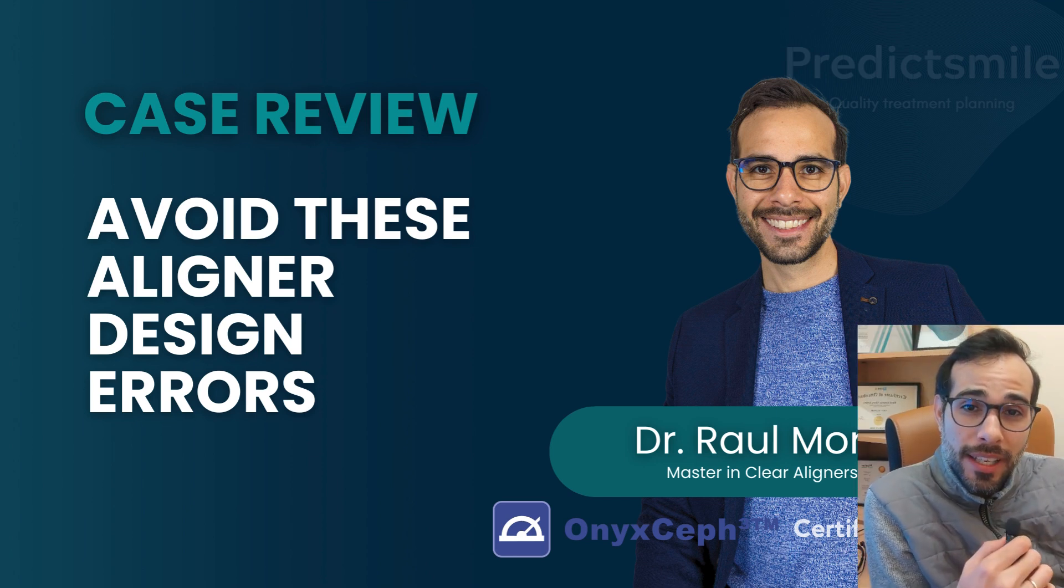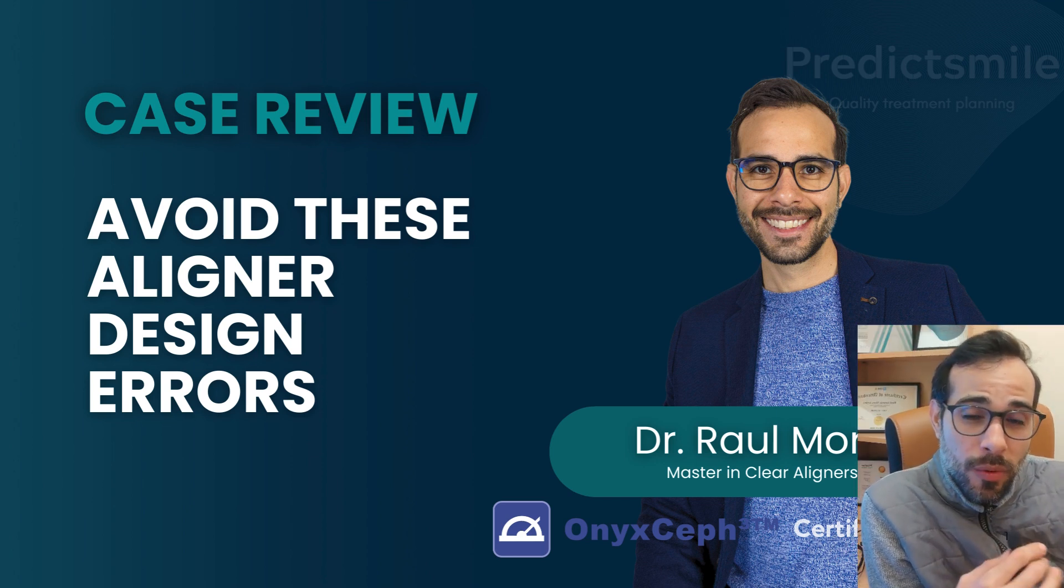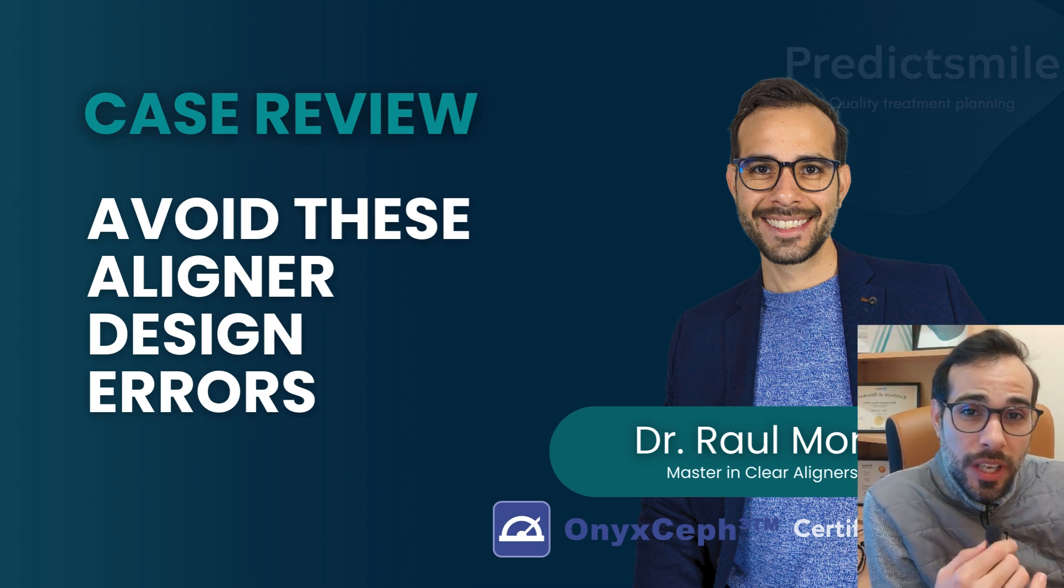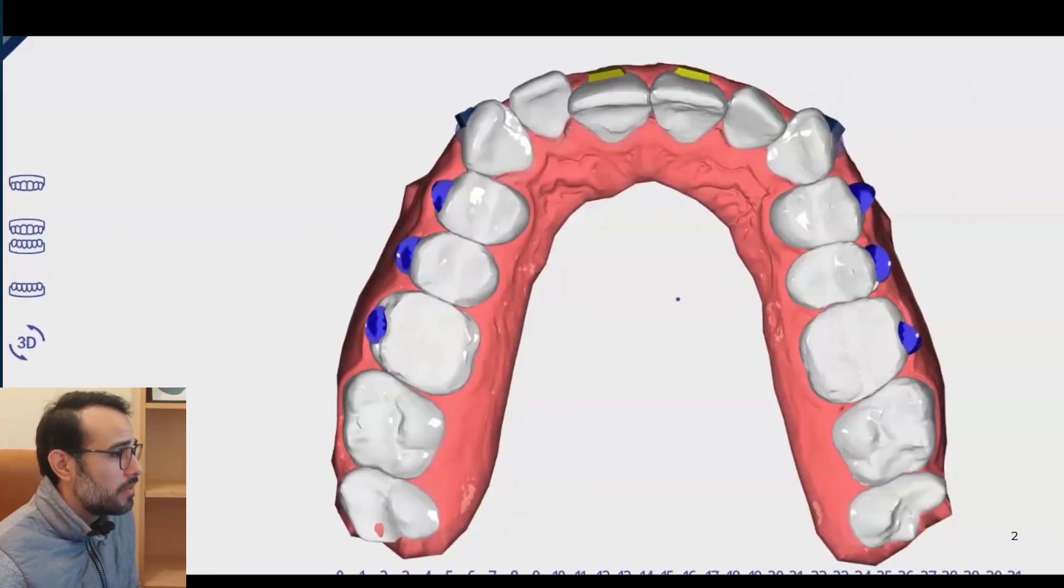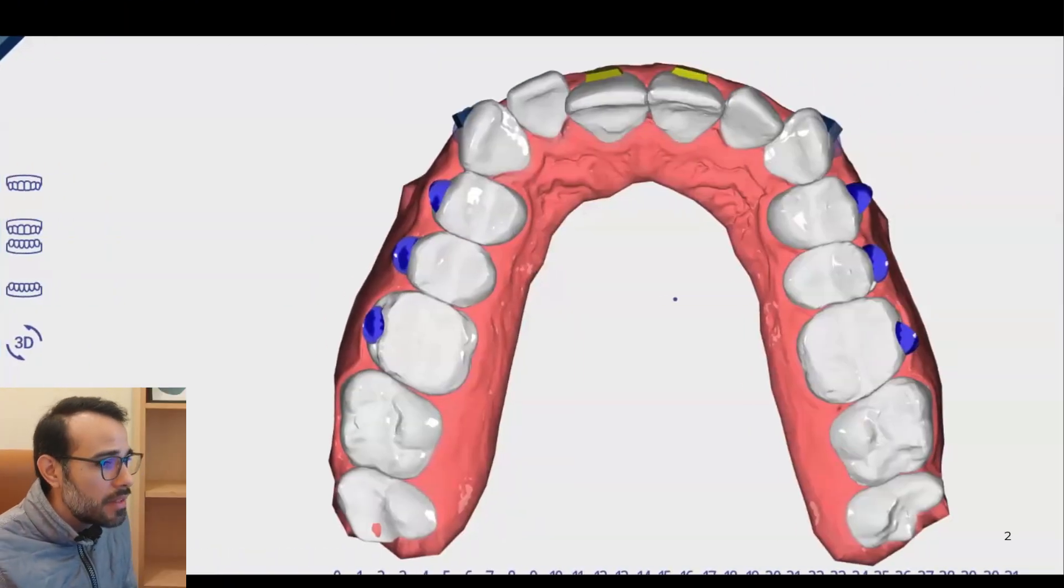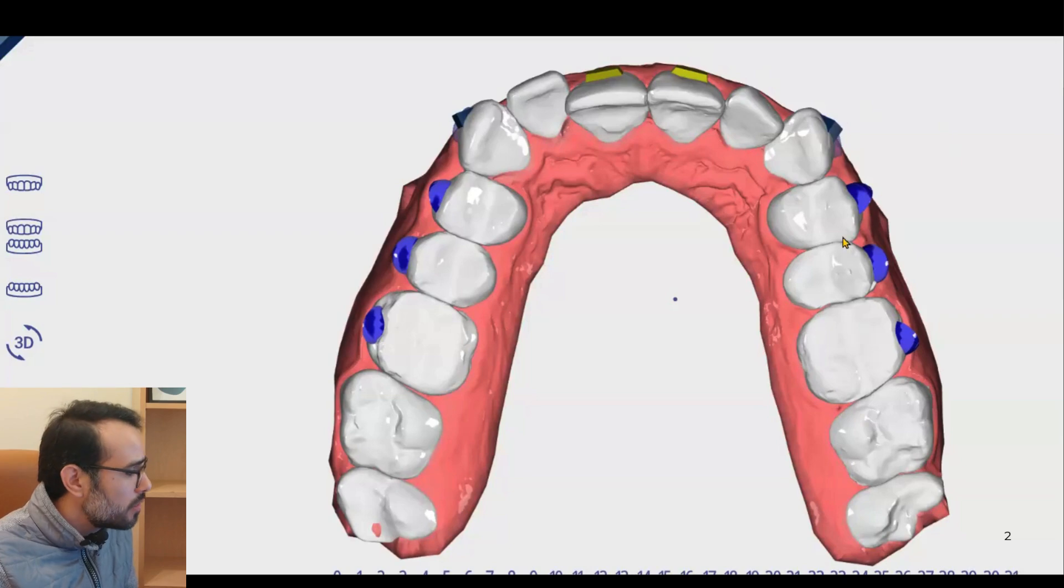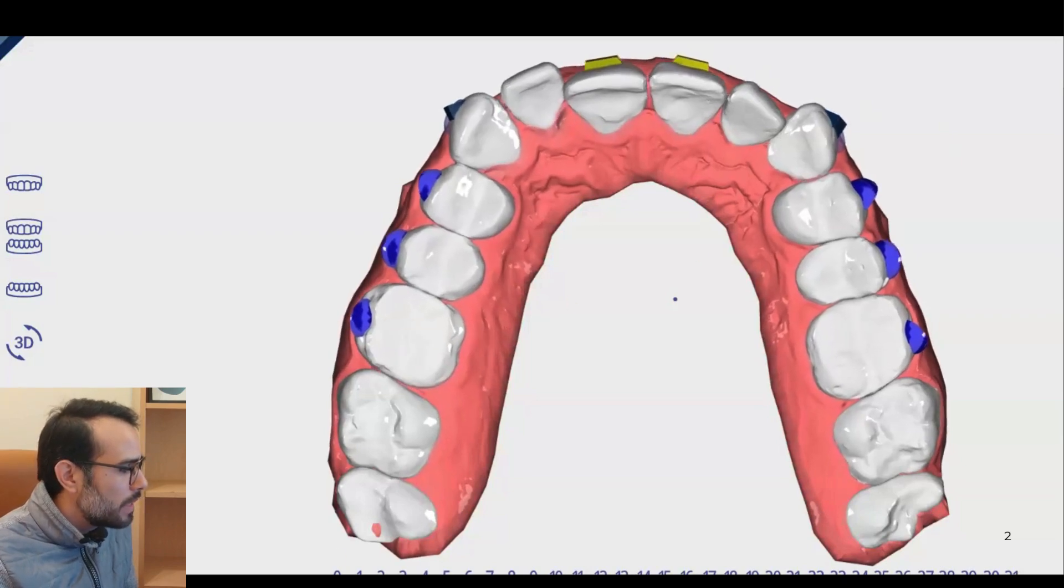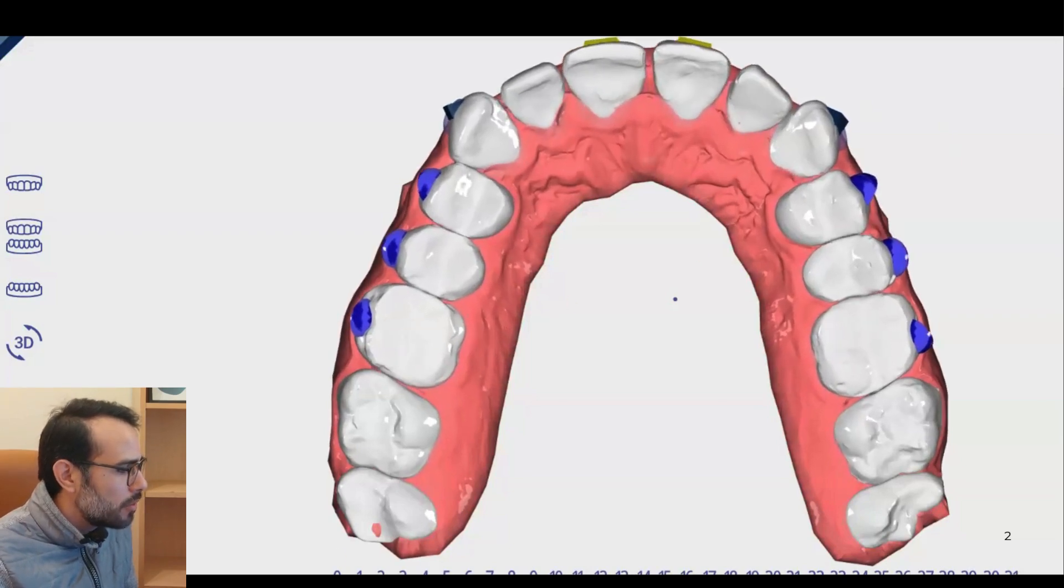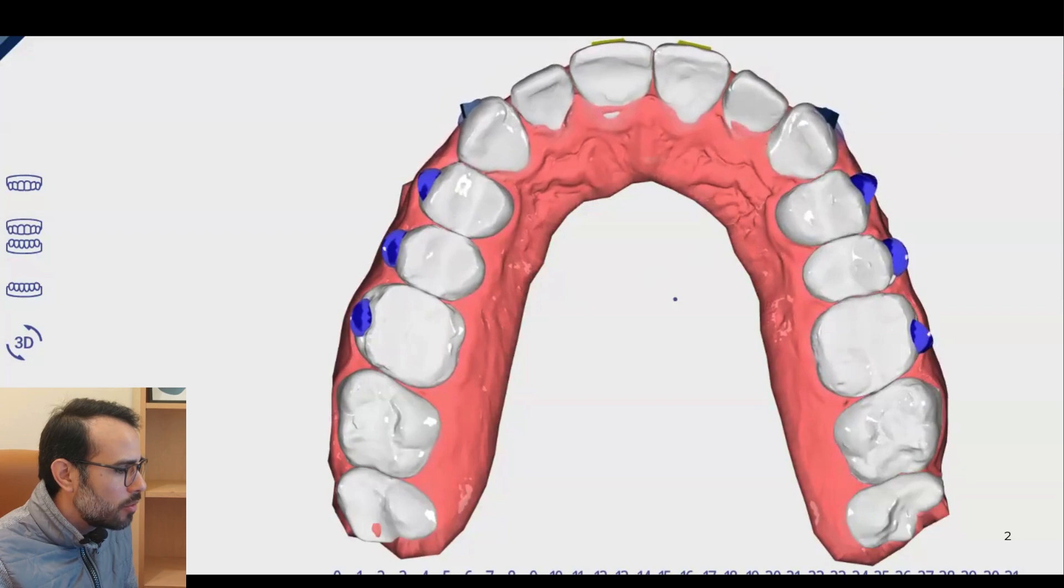Hello, guys. This is Dr. Mora again, and today I want to show you this new case review. You can see on the video we have this case in which we programmed some posterior expansion. Let me play this video and maybe play it slower so you can have an idea.